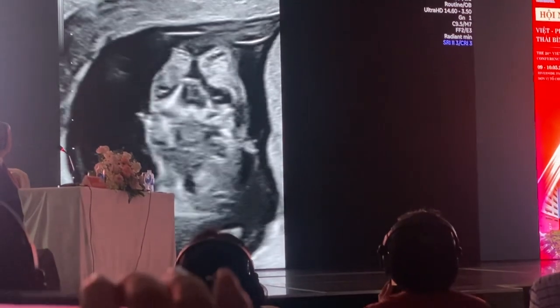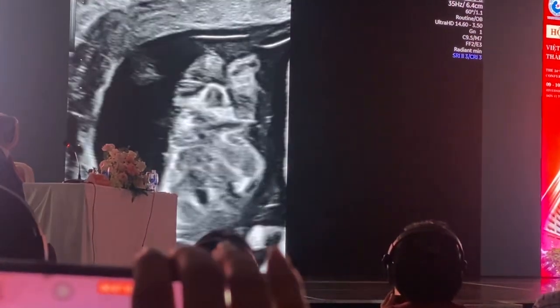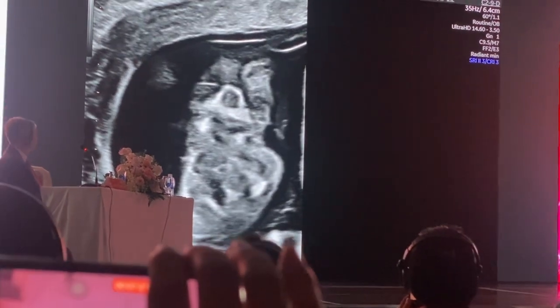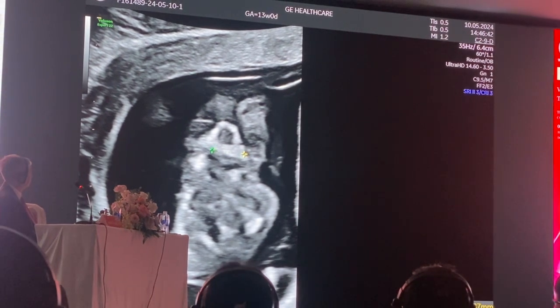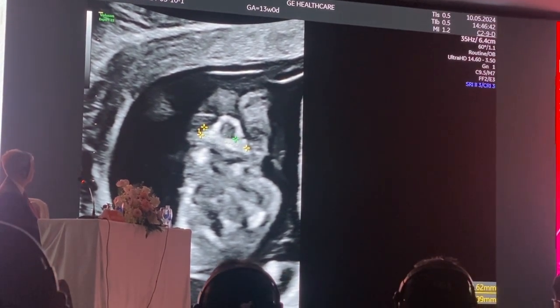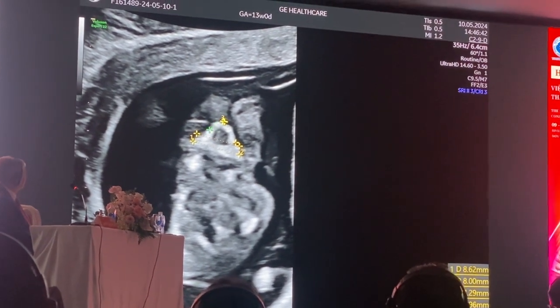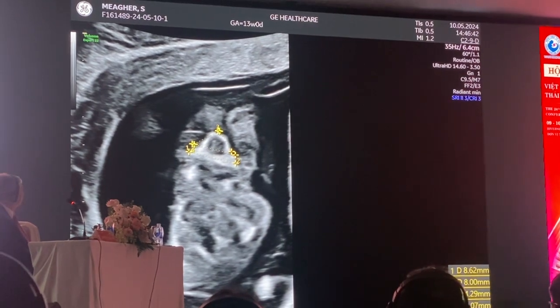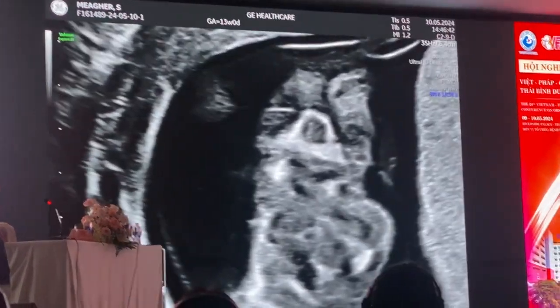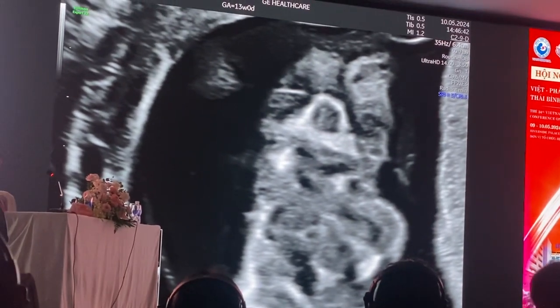I'm going to come down now and look at the retronasal triangle. So when I'm looking at the face, I look at the retronasal triangle, and I'm looking here over the bottom of the hard palate. So this whole structure here is the hard palate, and then here's my triangle leading up to this point here. That's important from the point of view of excluding the presence of a facial cleft, seeing a nice normal retronasal triangle.